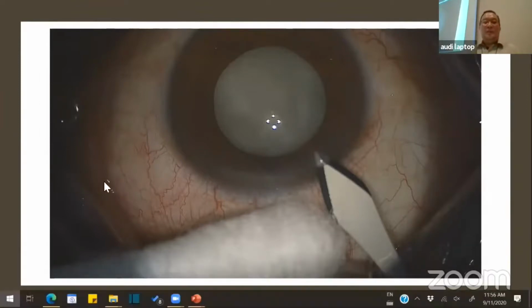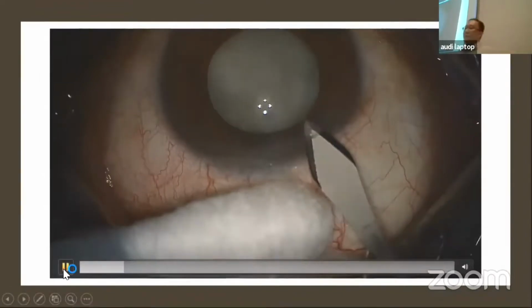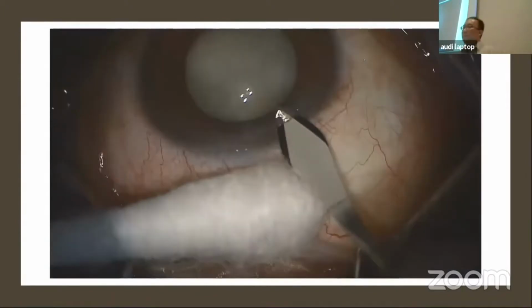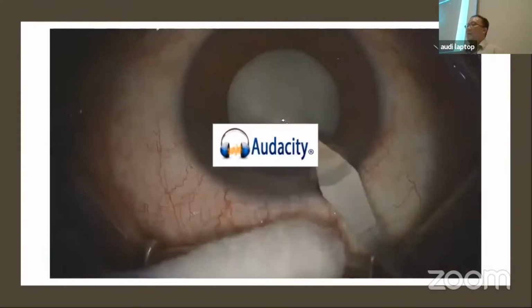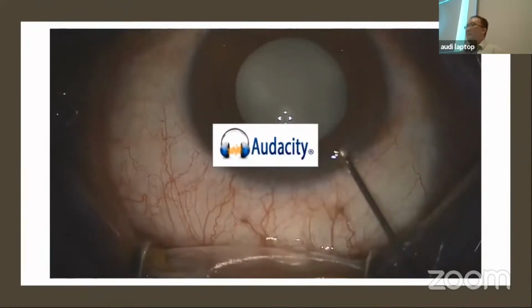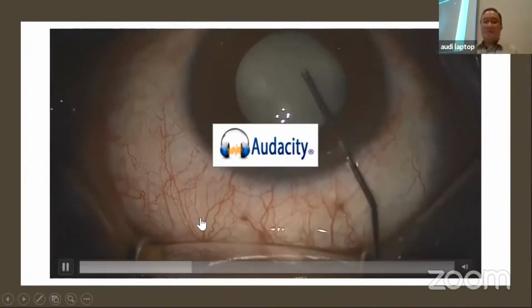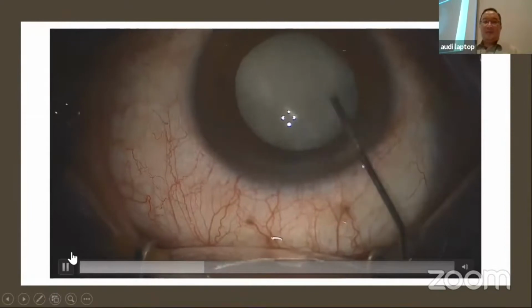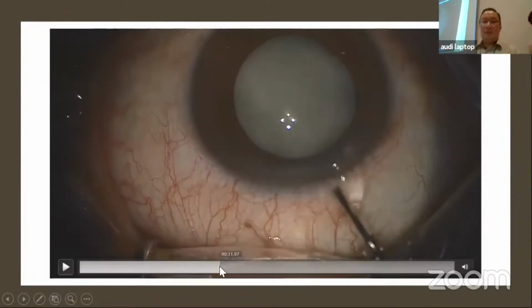Look at it again. Okay. Again. You see gush of fluid come out. Is it clear? Is that clear? Nazra, can you respond? Is it clear? Okay. There's lagging. Again, try again.